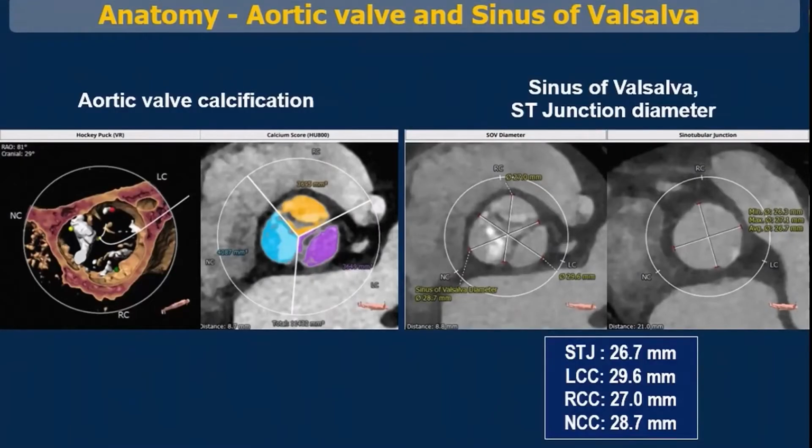First of all, I'd like to summarize the previous study case that had sinus valsalva tear and ascending aortic dissection. Slide, please. The patient has eccentric calcification in the NCC. It looks not so ugly because the NCC sinus valsalva space is 29 millimeters.